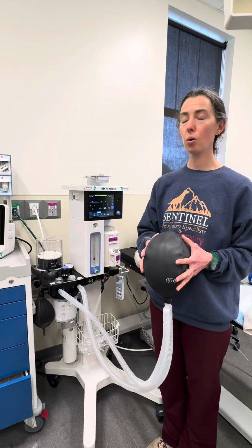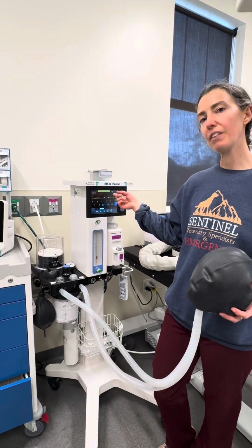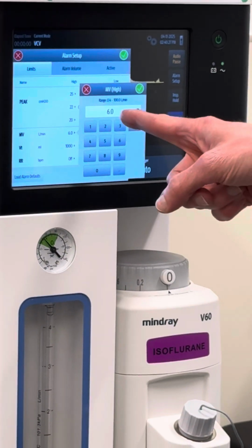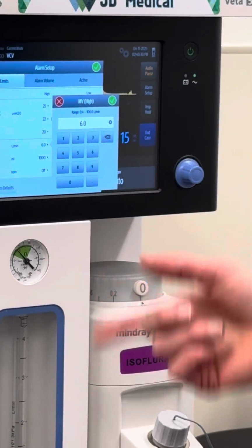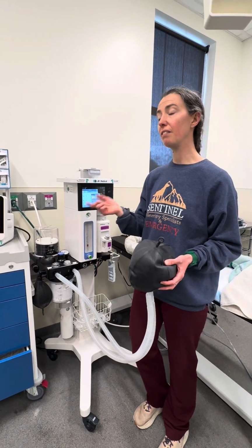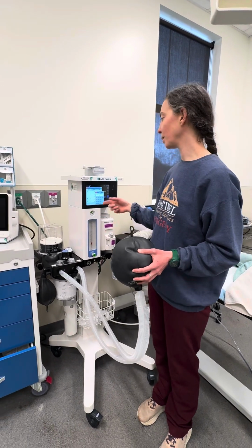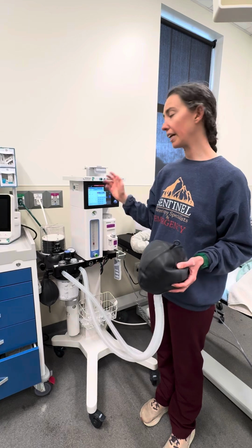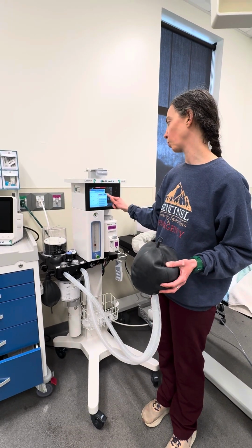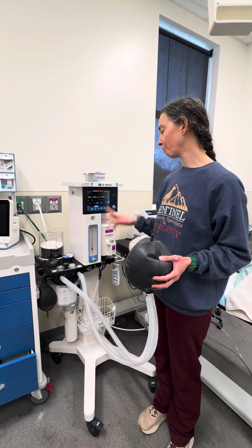Okay, so the surgeon finishes closing. So this alarm, minute ventilation too high. The machine's preset to a minute ventilation of 6 liters a minute, which is roughly equivalent to human minute ventilation. And minute ventilation is your respiratory rate times your tidal volume. So if your patient starts to buck or you have a big Great Dane on the table, you're going to have to change that. So I just put it to 12 because most patients won't go above 12. And then you'll be good to go.